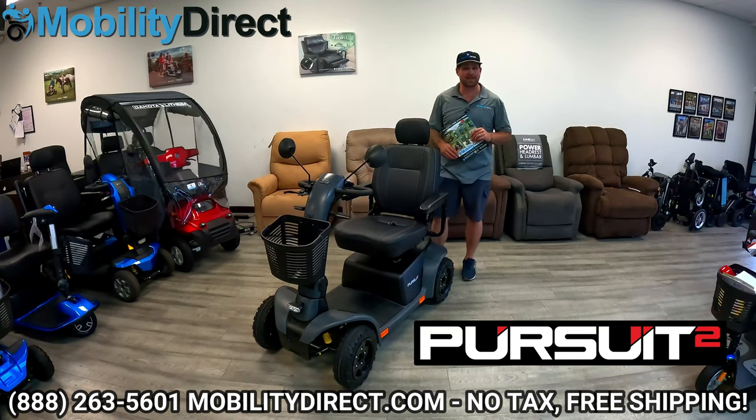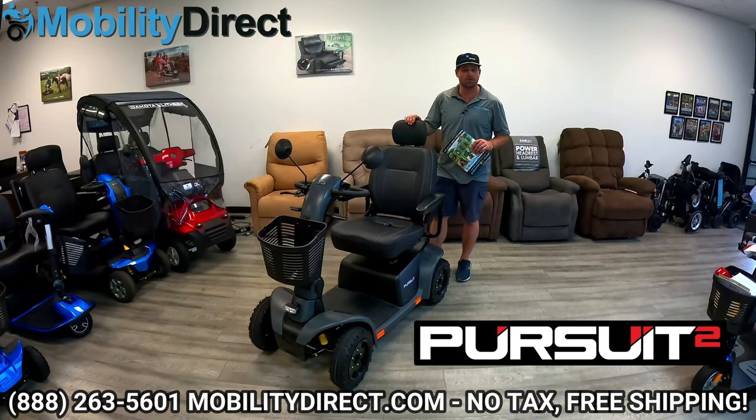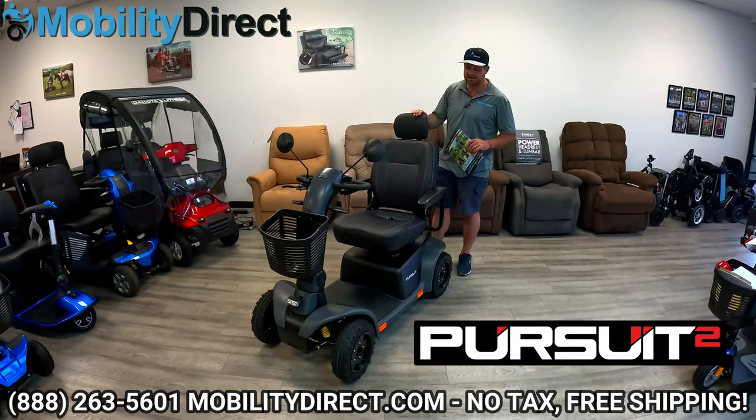Hi everyone, I'm Drew with Mobility Direct and I am super excited to review the all-new Pride Mobility Pursuit 2 Heavy Duty Mobility Scooter.